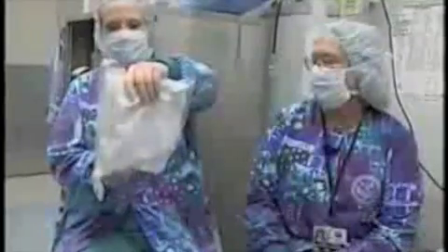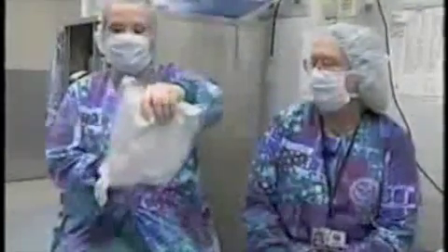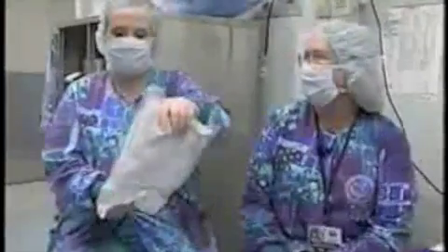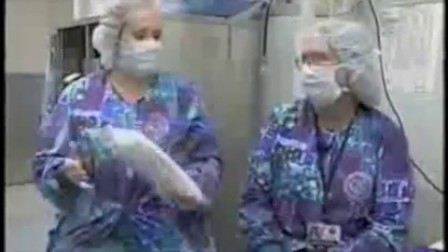In a sterile fashion. One of the problems is a packaging like this, where you have to pull it open like this, and then you're supposed to drop it onto the sterile table like this. This is very substandard. It makes it very difficult to dispense the item onto the table without contaminating it. Or this one. There is no method of opening it at all that will allow for a sterile delivery.